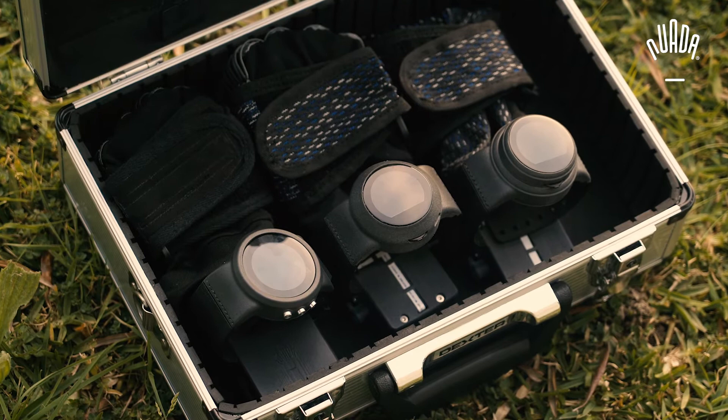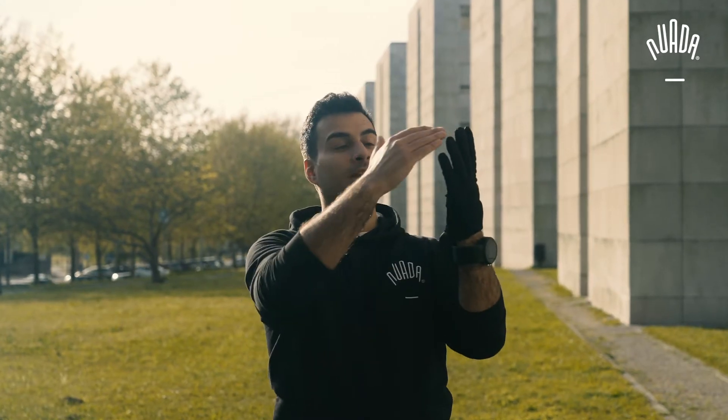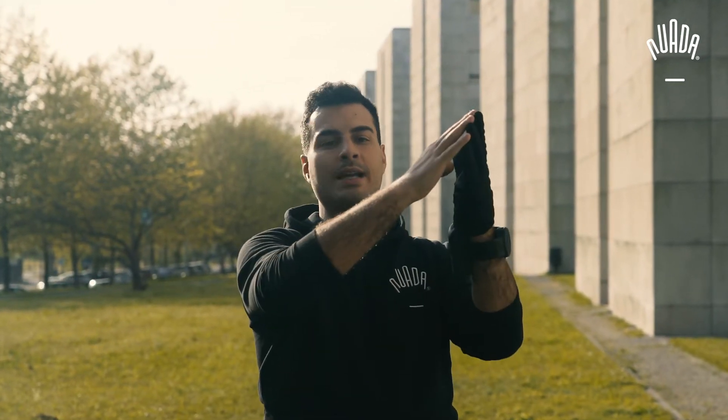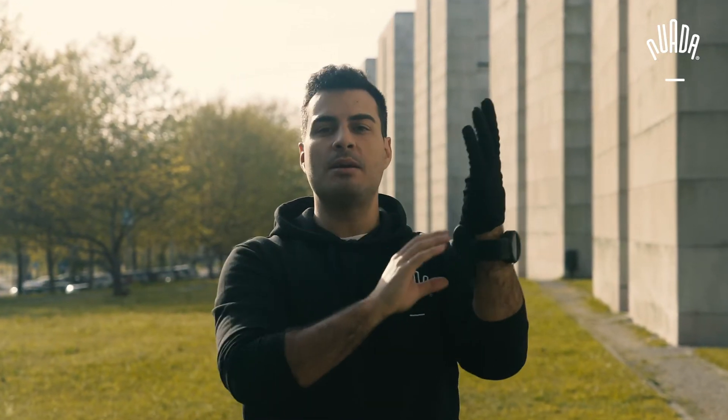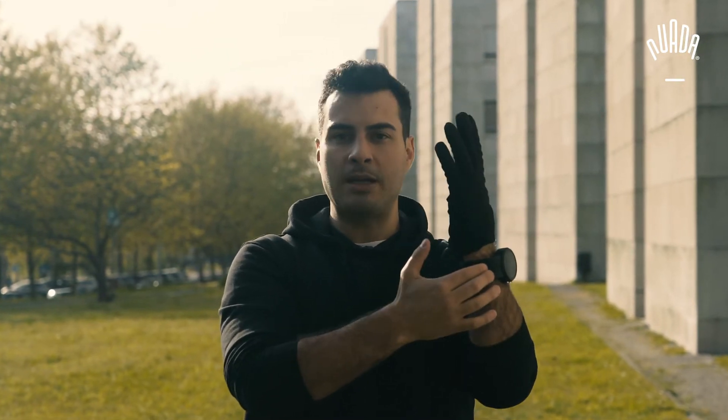Hello again! In this video I'll tell you a bit more about all of the components of the Nuada system and also explain what's included in the Pioneer spec. The entire Nuada system is comprised of the textile component, which houses sensors and artificial tendons. Those are connected to a support system which provides power to the user. All of these components are controlled by a hardware control system housed on the smartwatch, which also allows the user to input commands to fit their own needs.